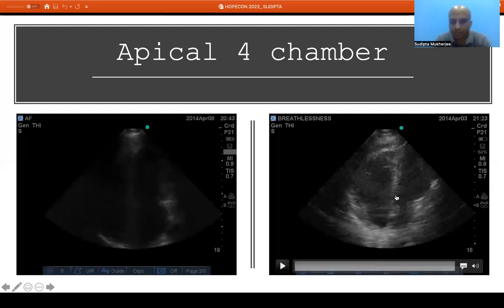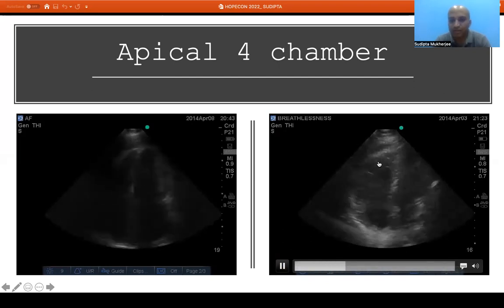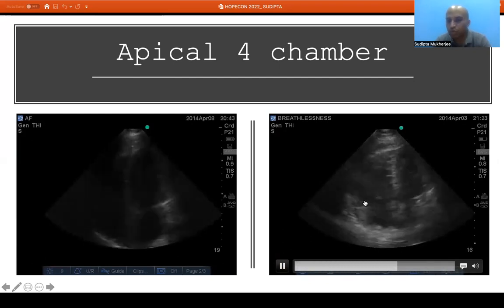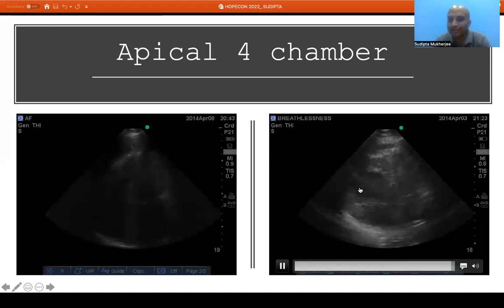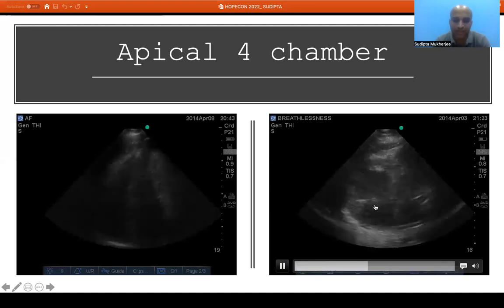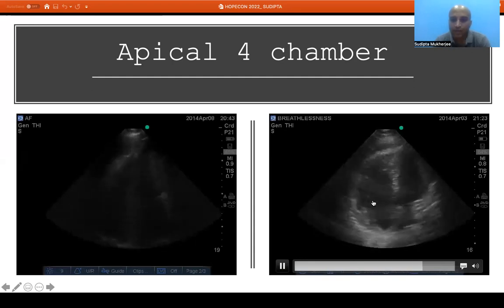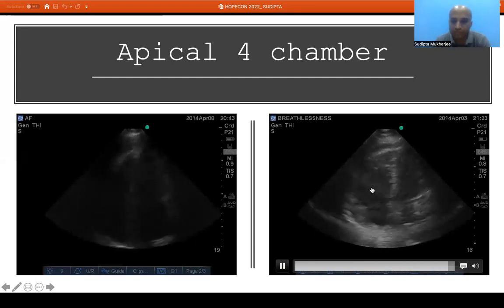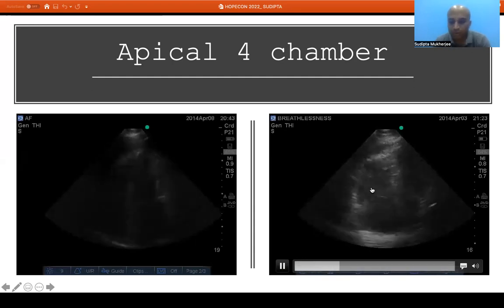In a pathological scenario — for example comparing a normal apical four-chamber view with an abnormal one — we can see that the right ventricle is dilated and the right atrium is dilated. If we suddenly encounter this clinical finding, we would want to rule out a pulmonary embolism.